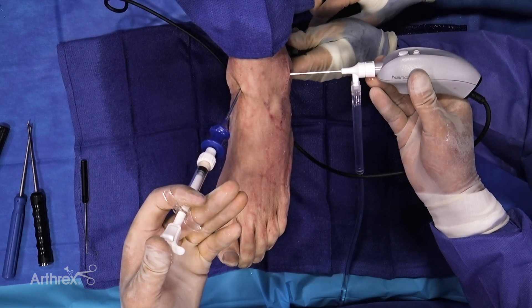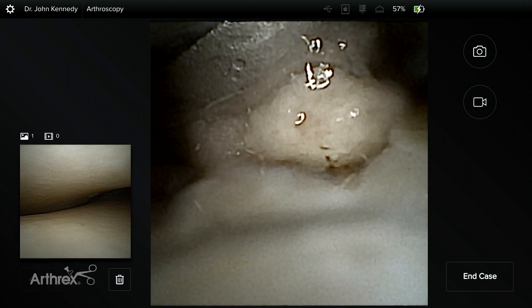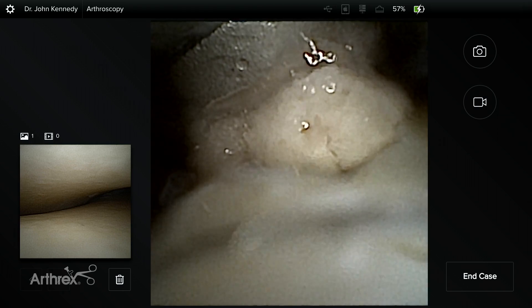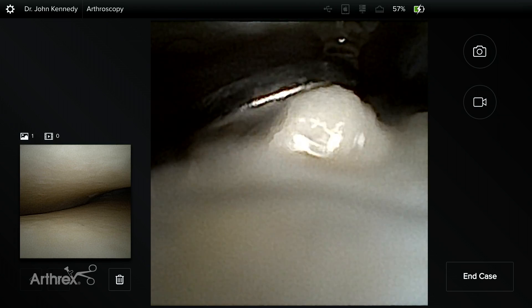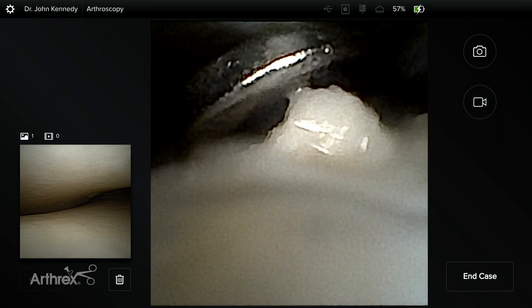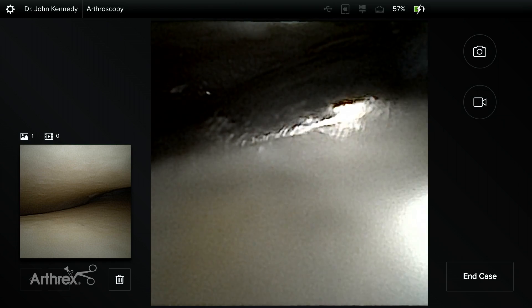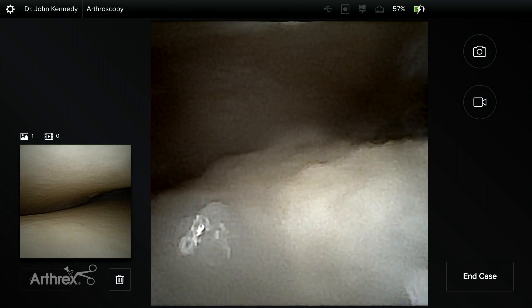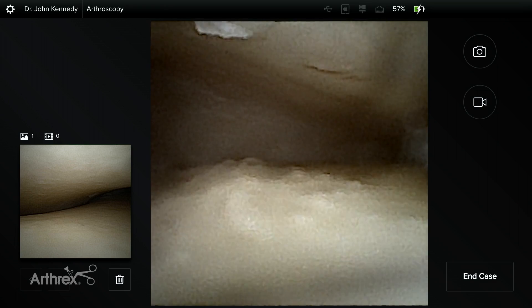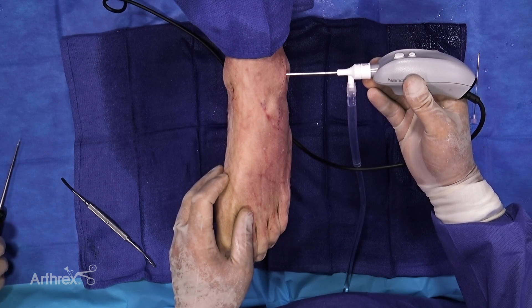As you can see now, we're injecting our biocartilage into the lesion — we only need a very small amount in there. Then we're just using a freer elevator to tamp that down into the defect. You can see that the defect has virtually disappeared. We know that by adding a biologic, we increase the chondrogenic potential of the graft.